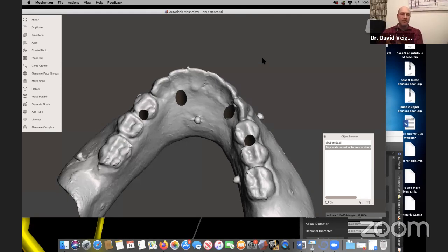So my workflow now is this. Surgery and the immediate load prosthesis goes on, which is based on a smile design prosthetic of the patient. That's getting me about 60% of the way to where I want the final tooth position, maybe more, 60 to 80% there.